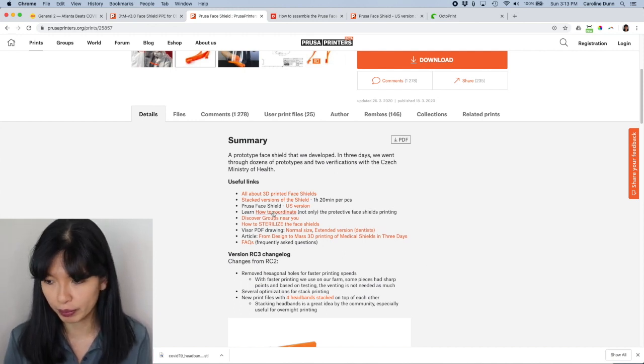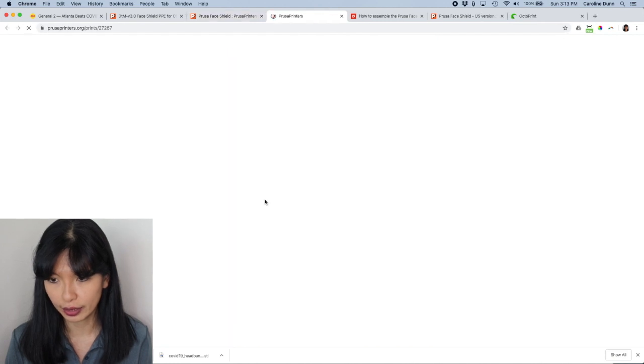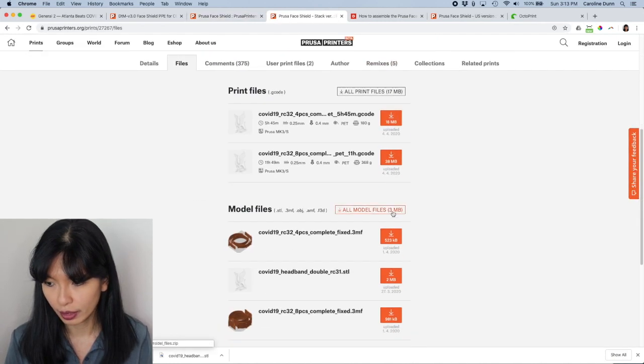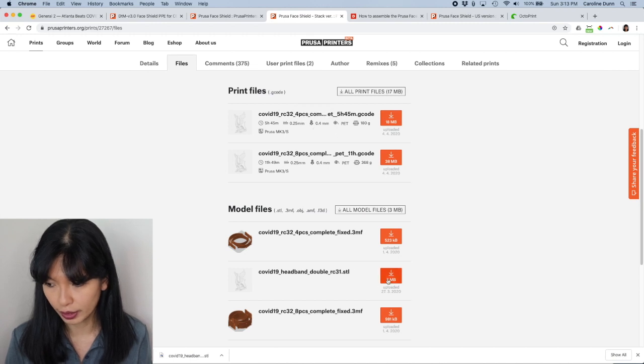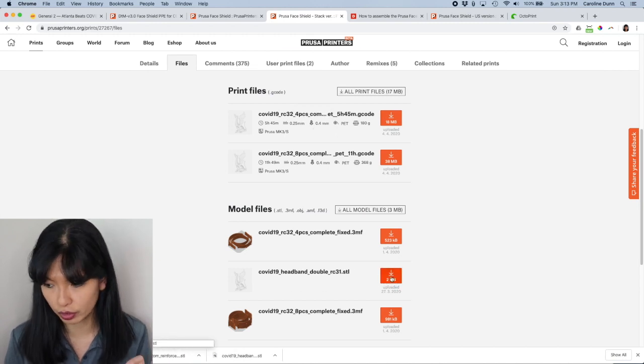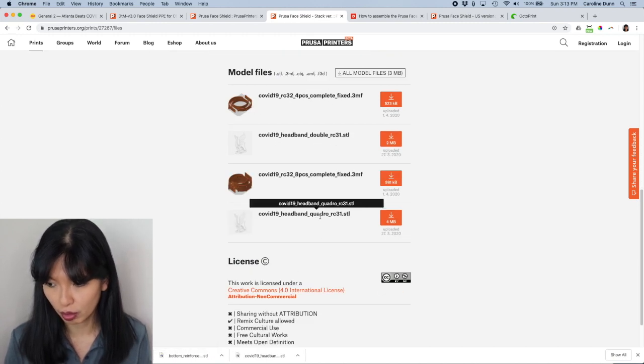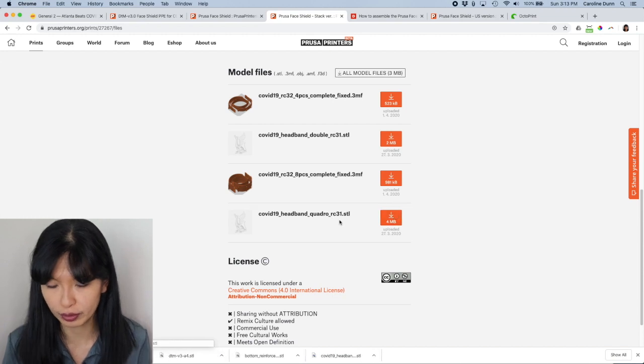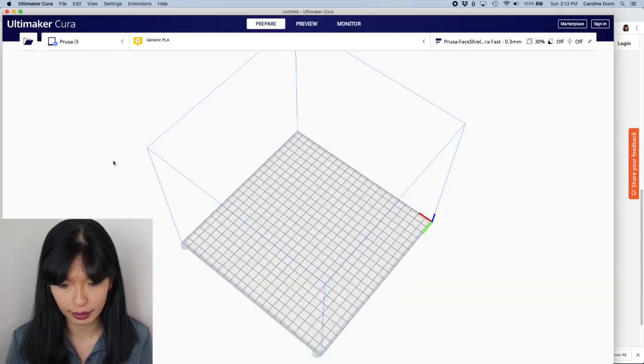From the Prusa website, there is called stacked versions of the shield. Click here and you hit download and then you can print double. So that's two face shields. Or you can print quadruple, four face shields.